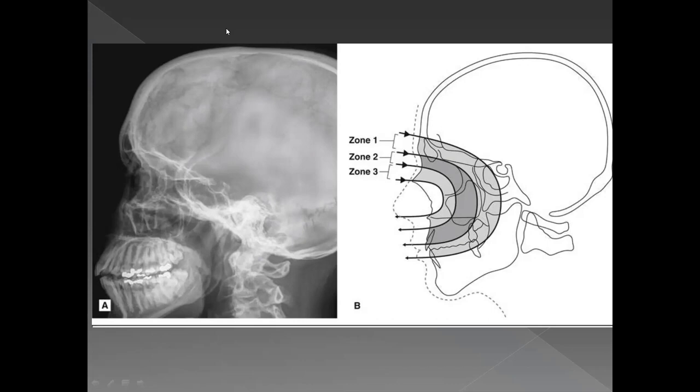Yes, exactly. It is basically a non-standardized lateral ceph. And again, we are not very fortunate. The only X-rays that we used to get of true laterals were on those old conventional films, not digital films. So those are not usually diagnostically very useful for us. So we still used to send the patient for a Water's view or some vertex view if it was indicated.